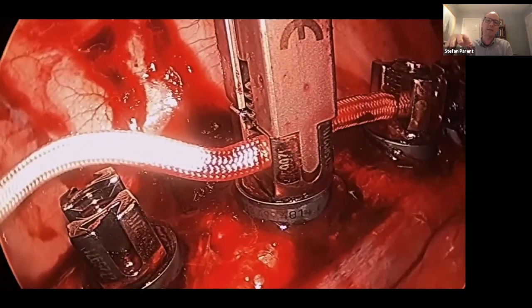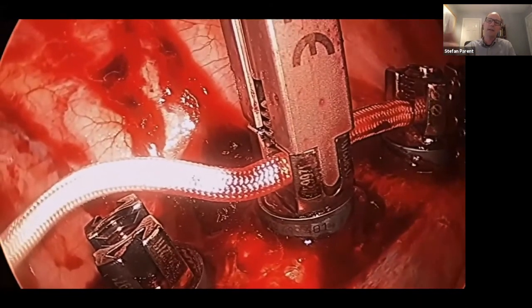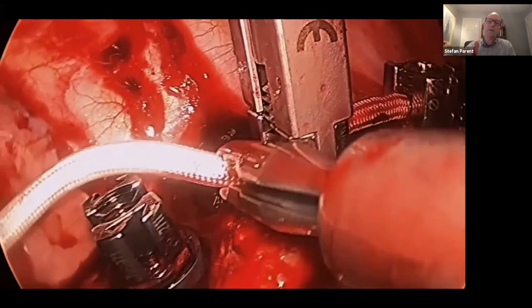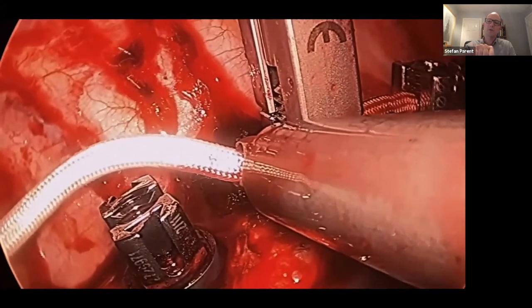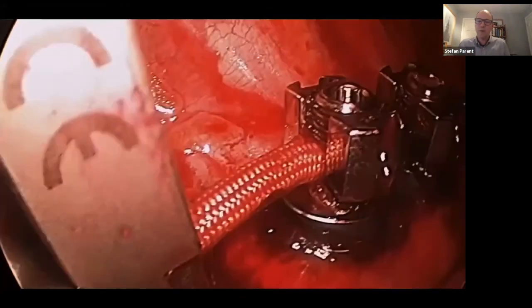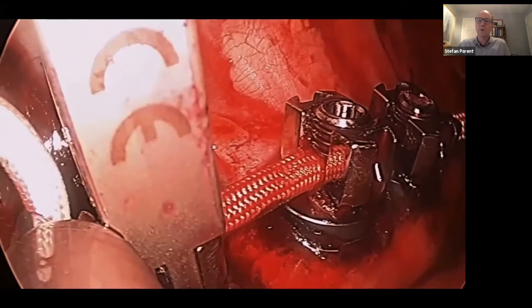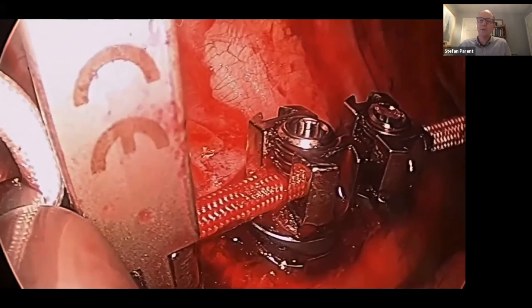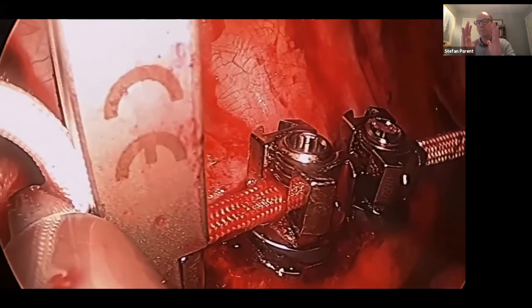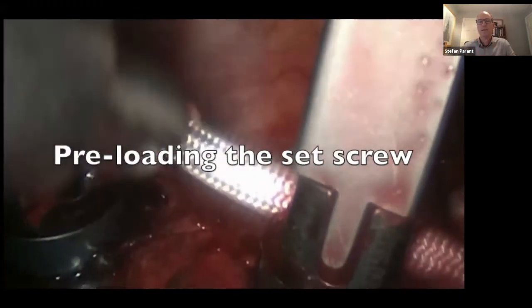So I preload my set screw, and I will come and grab that tether on the left side. So the tension is going to happen in between the two uppermost screws. I'll take my tether, and then I'll just start to twist it against my post there. And you'll see we'll go over and we'll have a better view, and you can see how much tension I can actually apply just by rotating that handle and just trying to get that tension in. And what you're aiming for is basically bringing that disc at the apex really parallel so that you can do this.